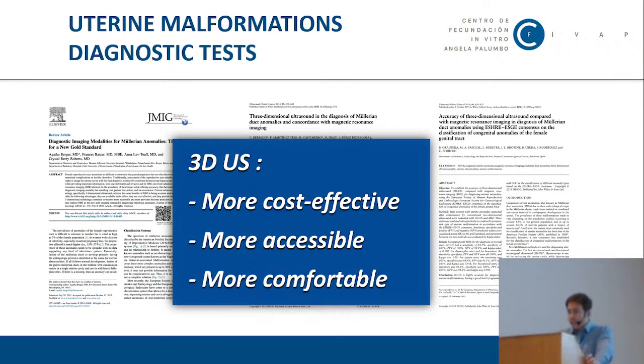And for the patient, 3D ultrasound will be more cost-effective, more accessible, more comfortable for the patient, quicker, easier, and very accessible for gynecologists to do.